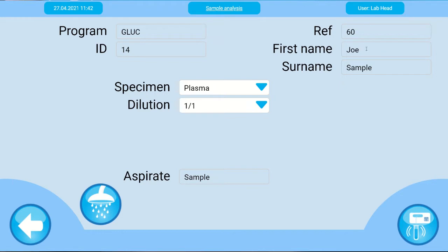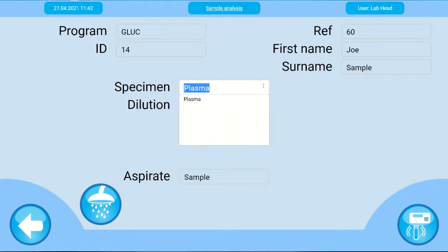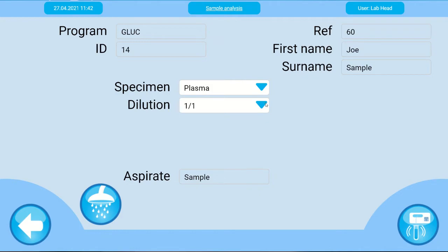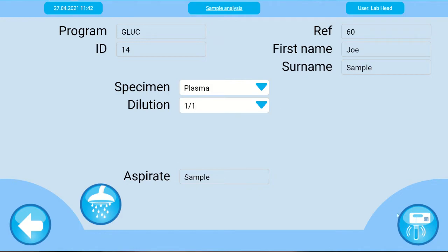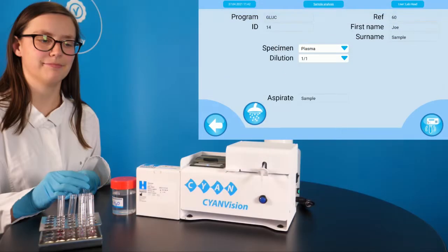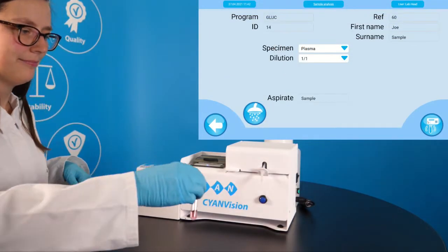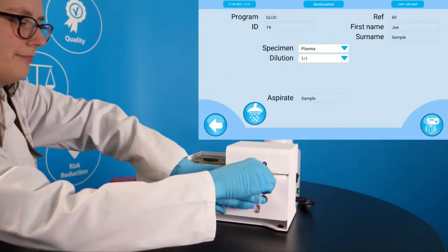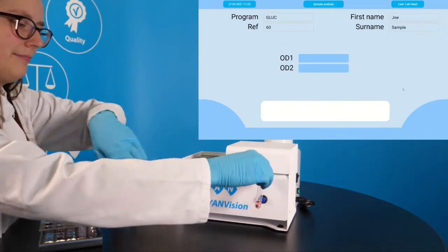The patient details shown include the reference, name and surname. Adapt the specimen type or the dilution ratio of the sample if necessary. Press aspirate and the measurement will start automatically.